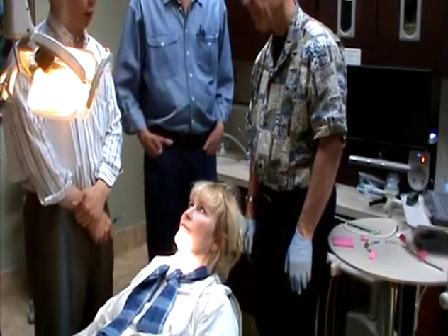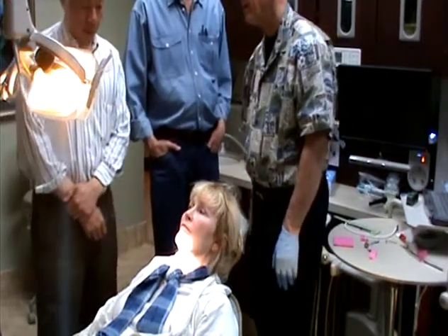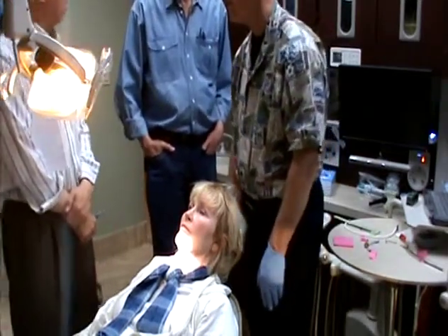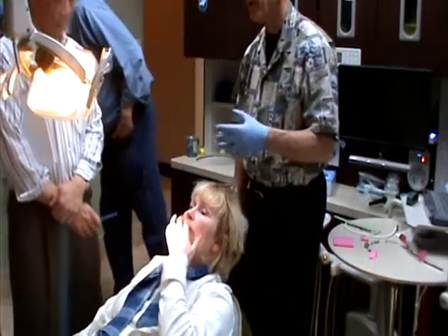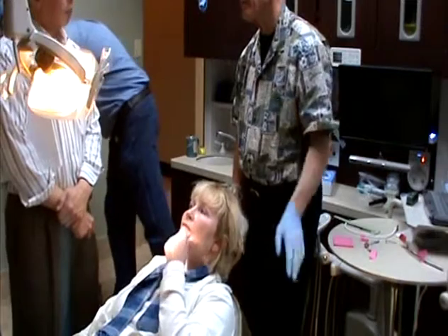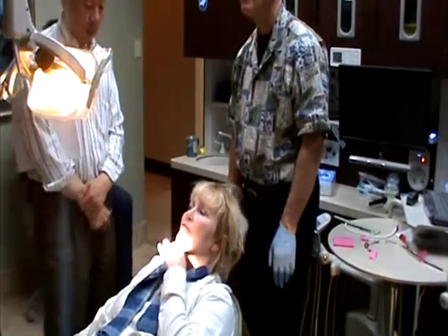And the best way to do that is with an L. I don't understand what, owl? ALF, advanced light wire function. And you would expand just on the left side. Okay, I'll get it right.